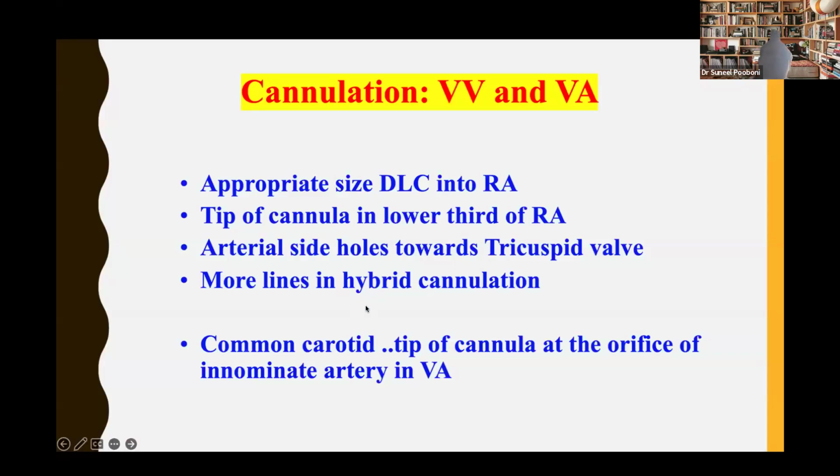More lines may be needed in a hybrid cannulation. You will read about hybrid cannulation in one of these classes. Common carotid or tip of the cannula as orifice of the innominate artery in the veno-arterial ECMO.